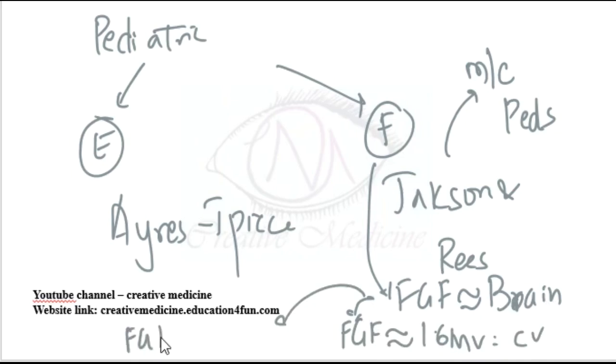Mapleson F can be used in children less than 6 years and in children less than 20 kgs.